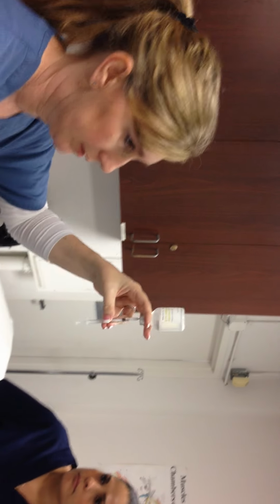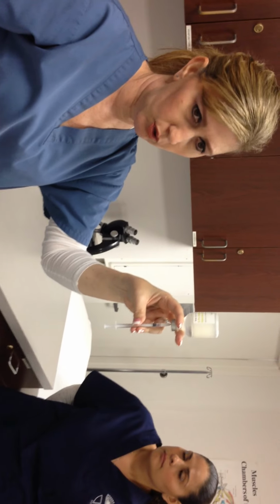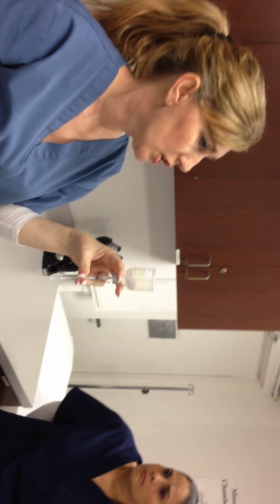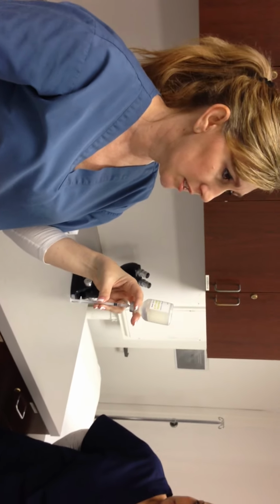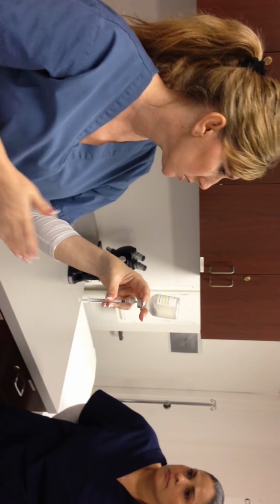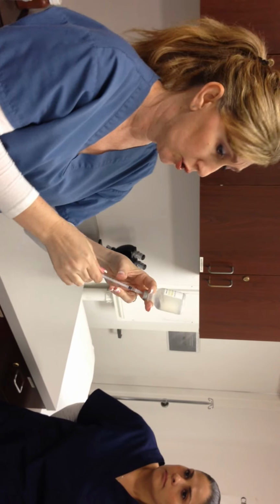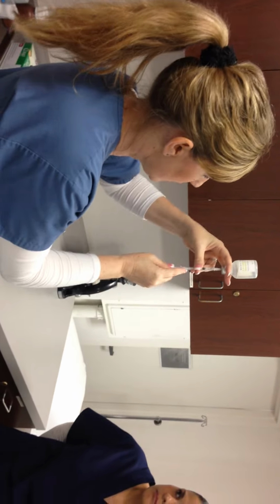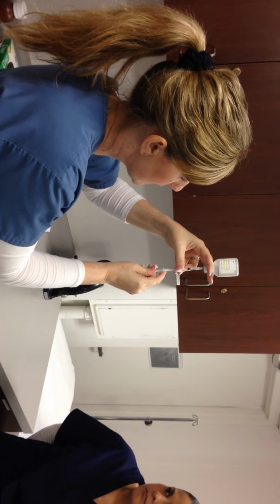OMG, there's bubbles. Okay, tiny little bubbles are not going to hurt anyone. We are not injecting into veins or arteries ever as medical assistants. We don't do that. We are injecting into tissue or muscle or skin or whatever, but we're not injecting into arteries or veins. So these tiny little bubbles are not a big deal. If you see them and there's too many, just pull it back down again.